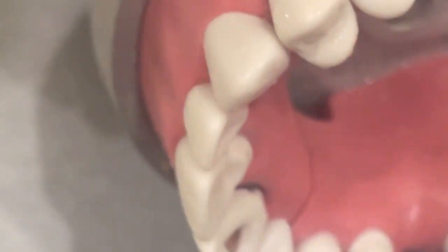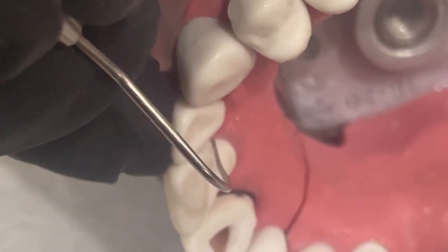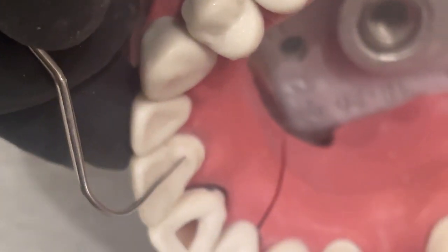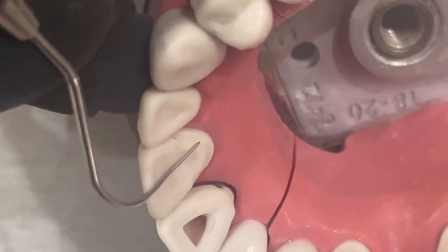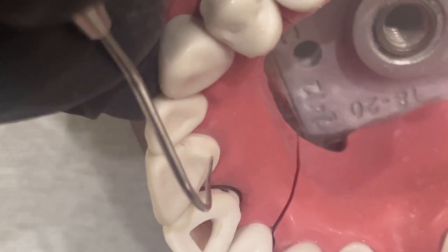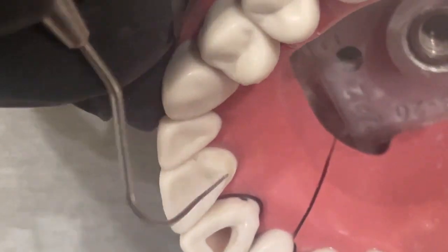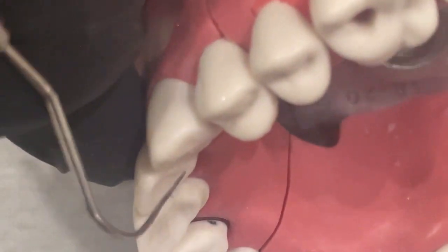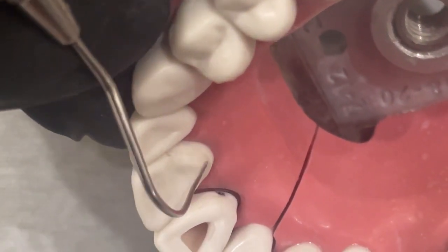I hope this is helpful. The most important part is: get the wall first, make a wall, and then just scoop out the middle and try not to touch this corner part too much — because that's what gives it that cingulum shape, going from a scooped-out shape to a drop. You just want to avoid the flat shape of the tooth itself. It's a little bit tricky, but try a couple and I think you'll be able to get it.